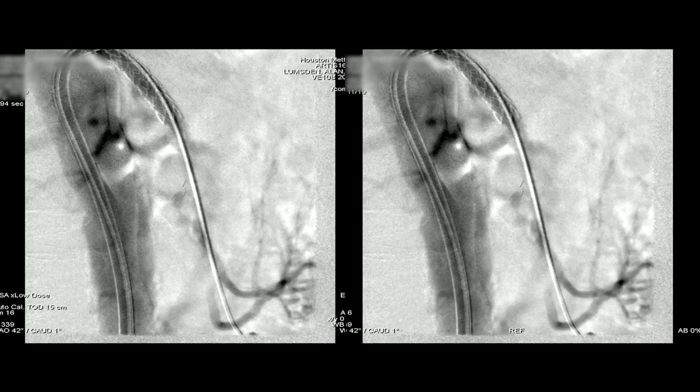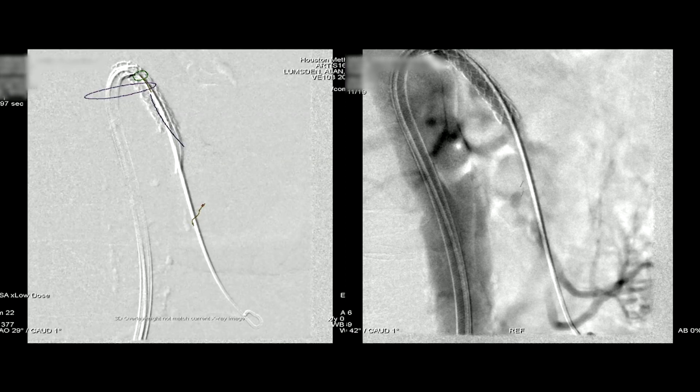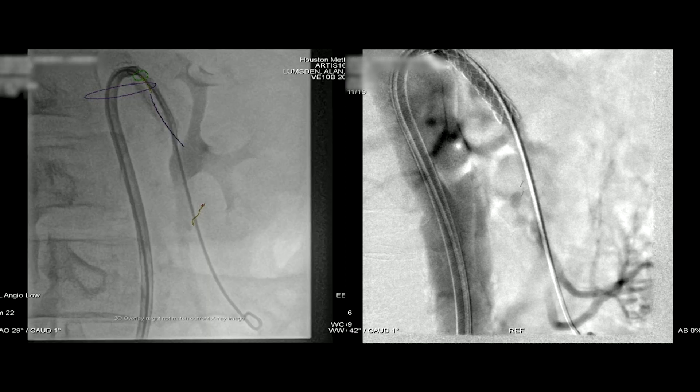That's essentially what we're trying to identify here. We shot multiple different views. We also look at the CT scan, but it's a little bit unreliable depending on the fusion because there's a stiff wire down there which tends to deform the small branches in the distal superior mesenteric artery circulation. So we're going to bring up another 5x29 VBX to cover the stenosis without covering any of these distal branches — that's really what we're trying to define, where that first branch is.